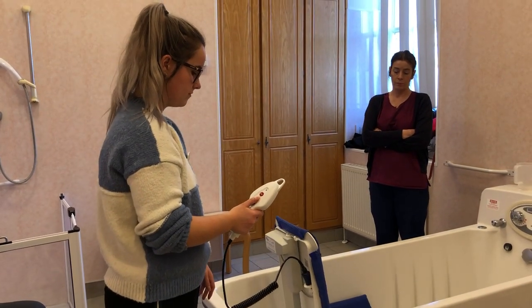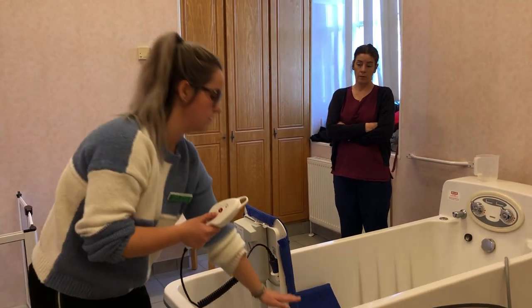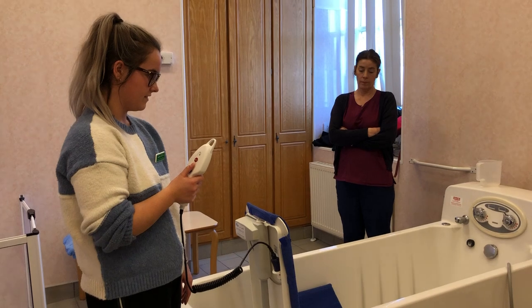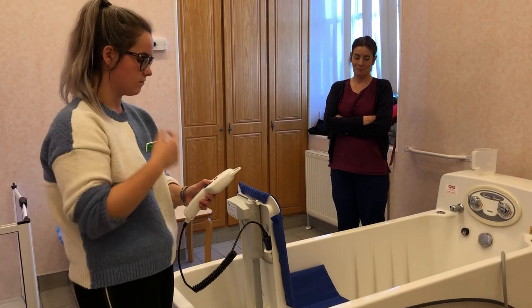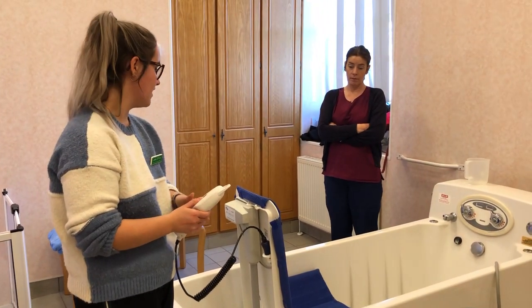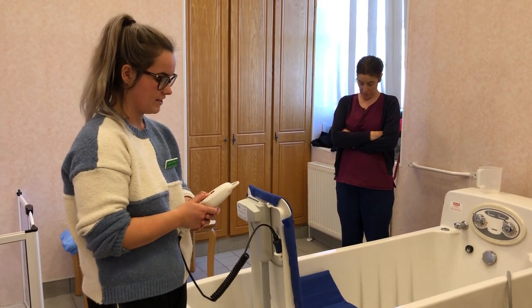There's an up, down, and stop button. So you bring the bath up — the backrest will come up first, and then you bring the seat up. This can take a bit of time, but you should bring it all the way up before trying to sit on it, because it's safer.